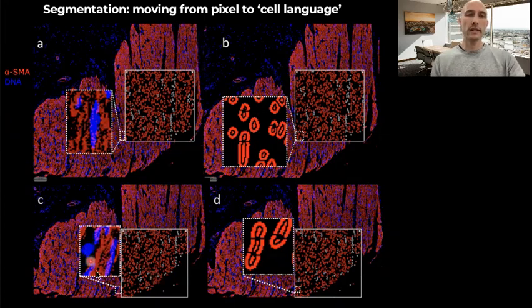And we did the same with another ROI. Here it seems to be only one spindle-shaped cell. But when you look at this image under the microscope, you can see that there are three, or at least two, cells. And the software recognizes three cells in there, overlapping each other. So as you can see here, our software did a decent job recognizing cells that are not round cells.